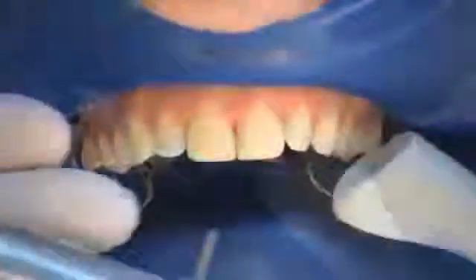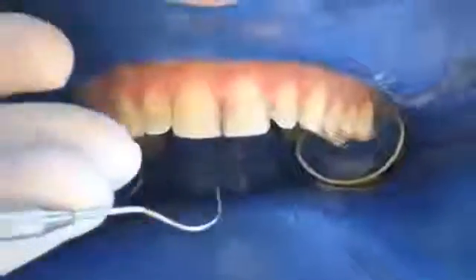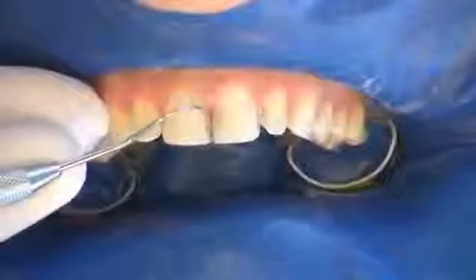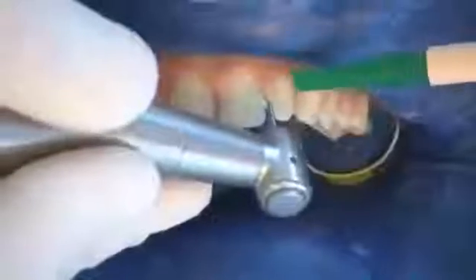This is followed, if necessary, by a reduction of the surface of the teeth, removing as little dental hard tissue as possible. A defined preparation margin, as well as shortening of the incisal edges, is not necessary. The teeth are checked for caries and old fillings. Caries in the dentine is removed in the conventional way, as are demineralized and discolored parts of the enamel.